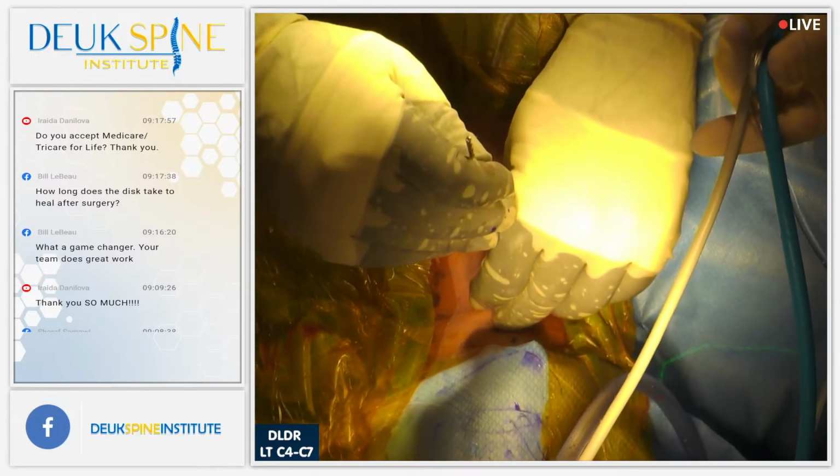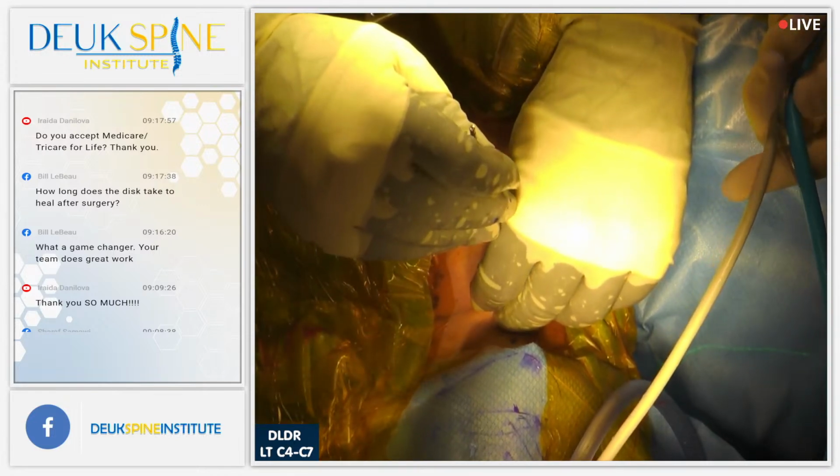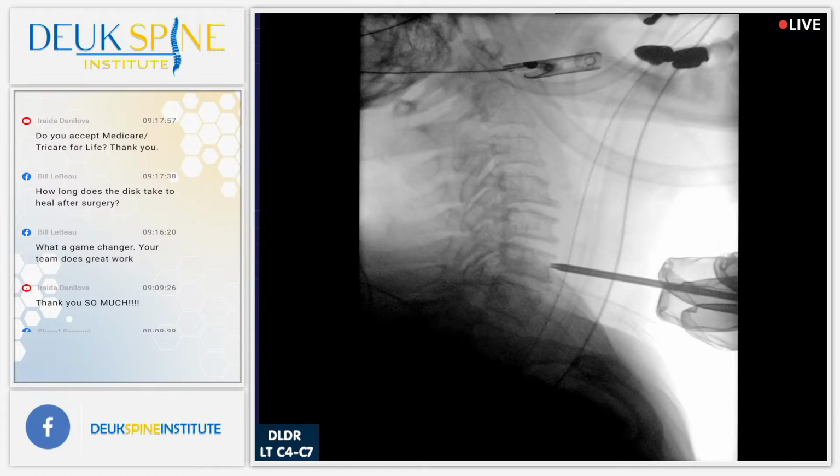I'm going to first come out with the dilator, and as soon as I get to the edge of the disc, the front part, I'm going to let the tip come out and slide south, and I have to feel this. So if you can't feel your hands, do not do this kind of surgery. You have to have great feeling, okay? I could feel it come out.